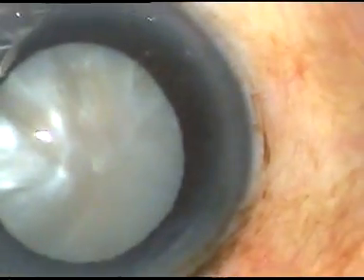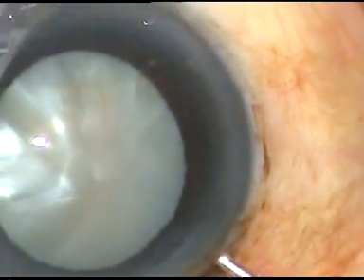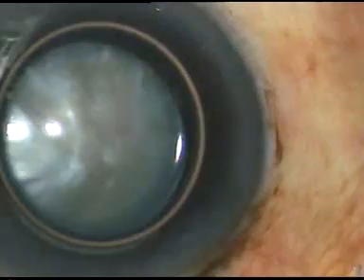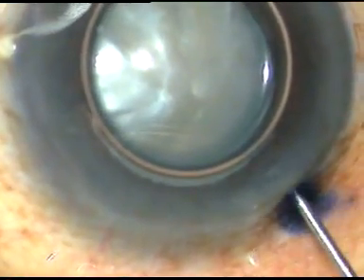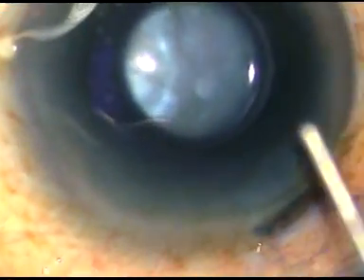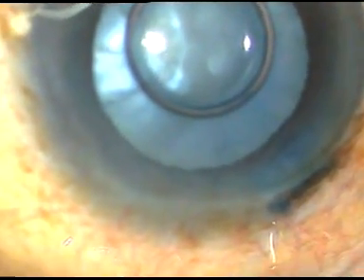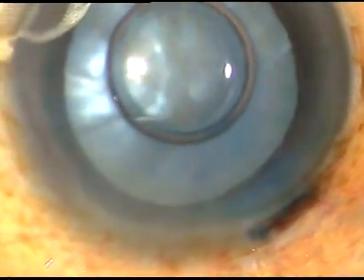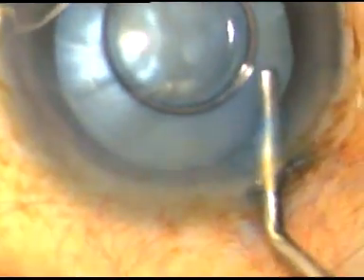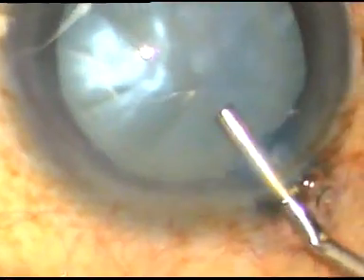The pupil has dilated but not fully — it is mid-dilated. I am staining the anterior capsule with trypan blue dye. Now I am injecting adrenaline to see if the pupil dilates, and see the magic of adrenaline. The pupil is dilating, and within seconds it dilates fully. I am very happy that the pupil has dilated very well now.